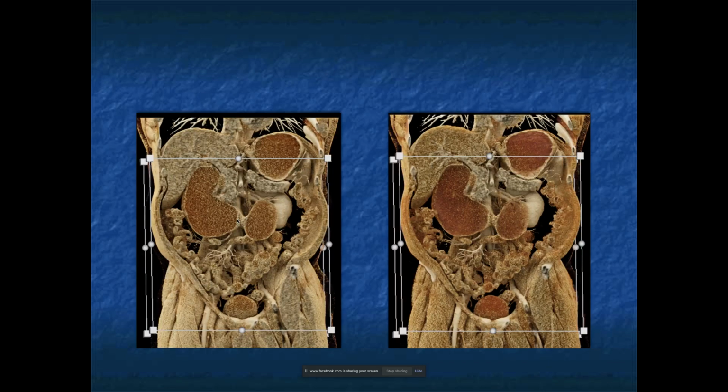Well, again, if you talk about multiple strictures and you don't see any adenopathy, but multiple strictures really makes you think about the possibility of something inflammatory. This was biopsied, and this ended up being a really nice example of Crohn's disease.